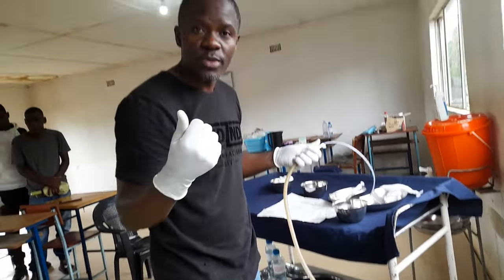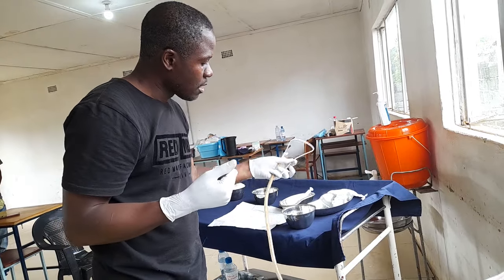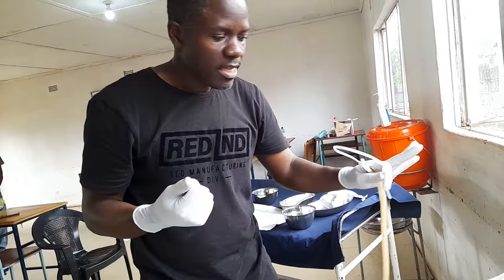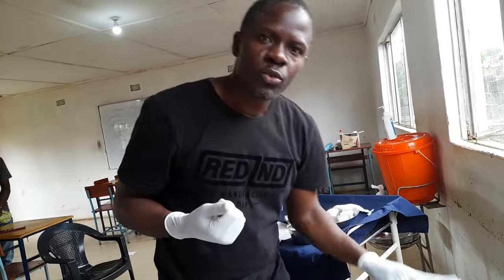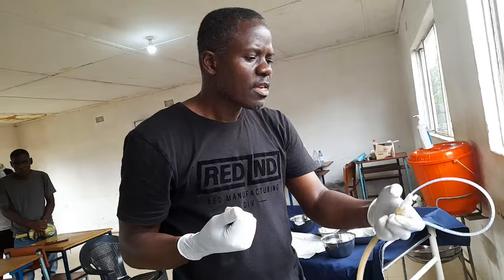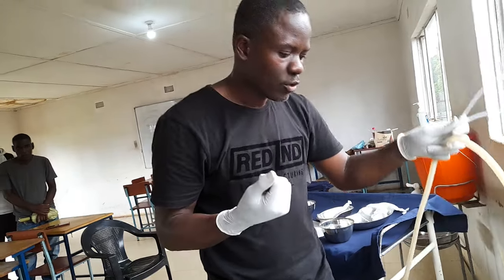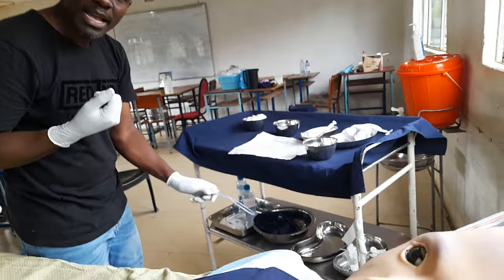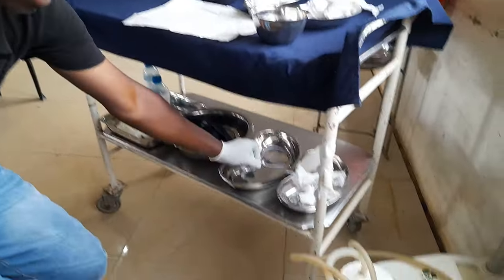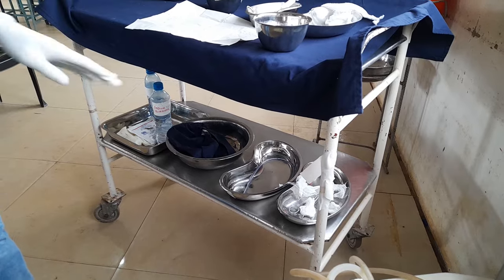At this point you are through with the suctioning. With the same contaminated hand that switched on the machine, switch it off. Disconnect the suction catheter from the suction tube and place the suction tube aside. The suction catheter should go into the sodium bicarbonate receiver — immerse it so that it is decontaminated.